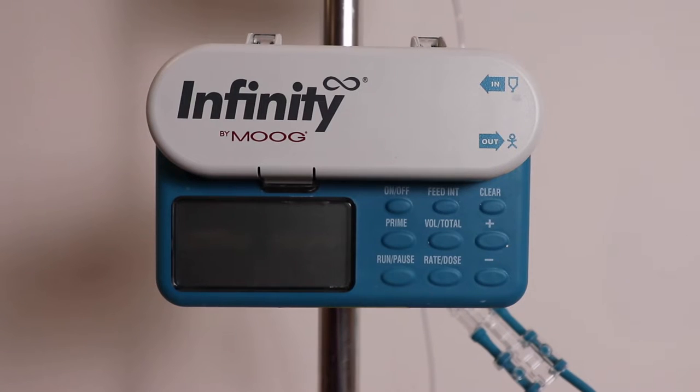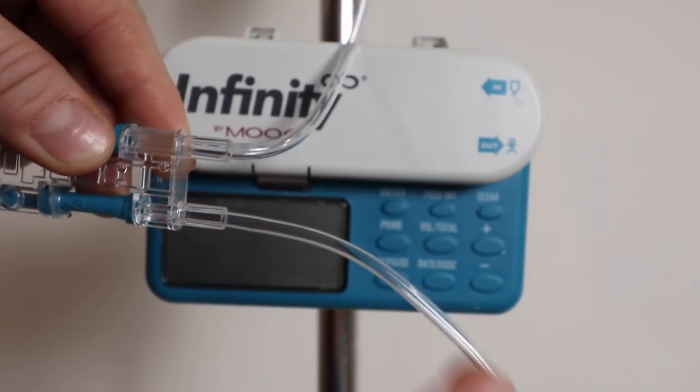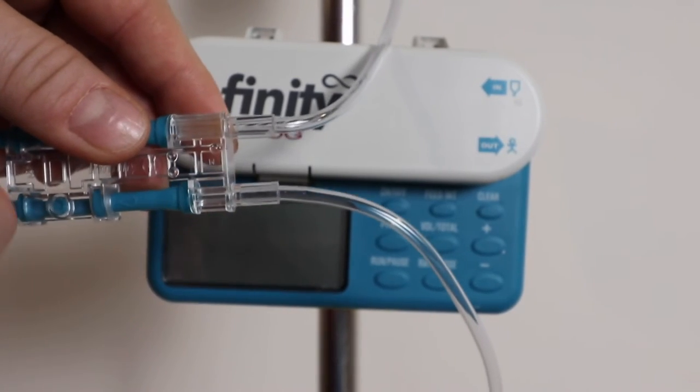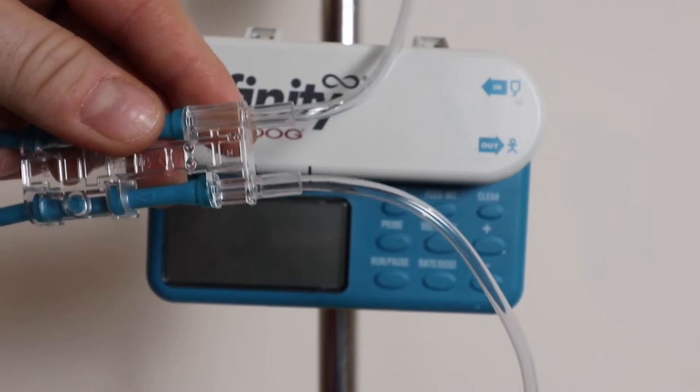Once you've added the food to the bag, it's time to prime your line. The line is currently empty and full of air, and you need to fill it with food because you don't want to pump air into your child's stomach.